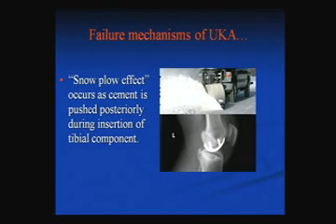This is something I call the snowplow effect, being from Minnesota, but it is very common. It occurs as cement is pushed posteriorly during insertion of an all-poly tibial component. And if you can see this, I've circled this little piece of cement. I've had 2 of these.